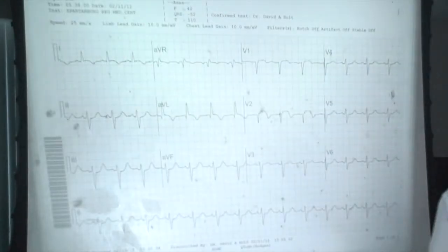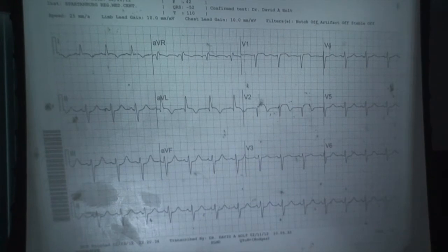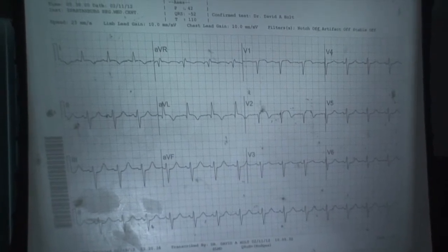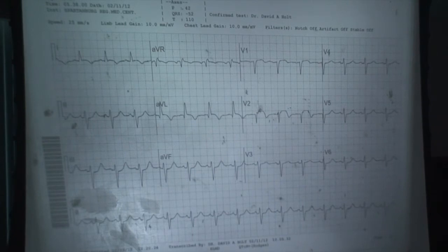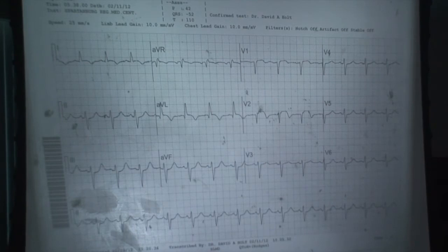Curious. What do we have there? Dr. Naismith, what do you think?